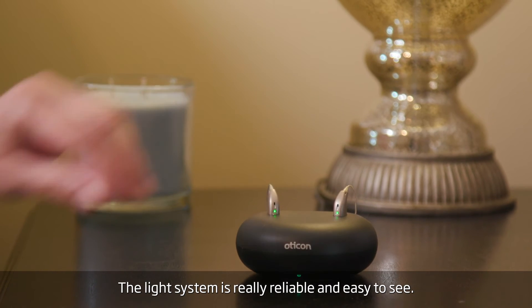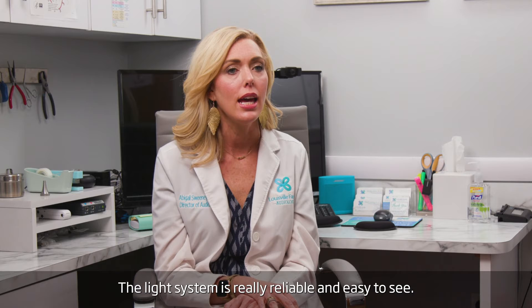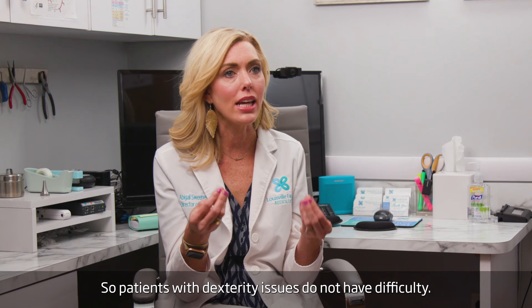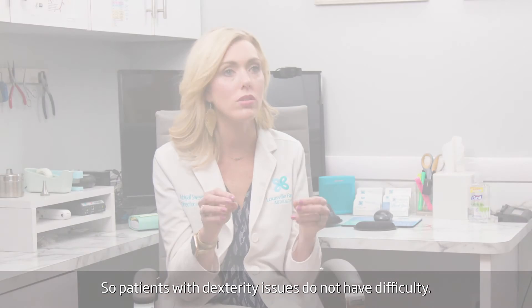The light system is really reliable and easy to see. And the other nice thing is that you can drop them in, so patients with dexterity issues do not have difficulty.